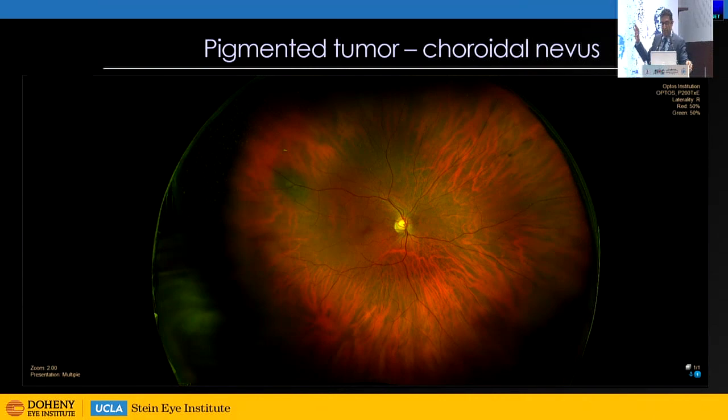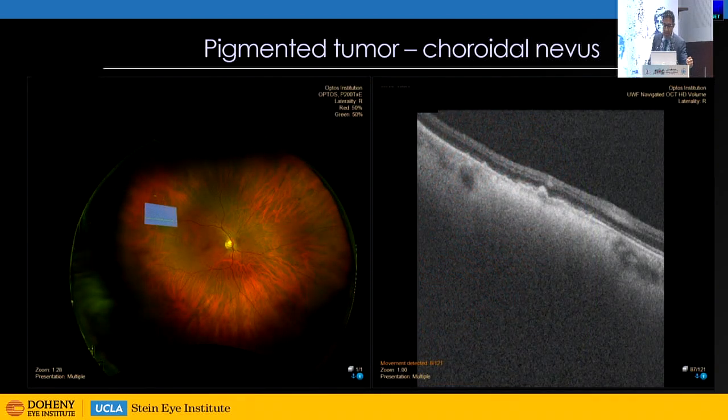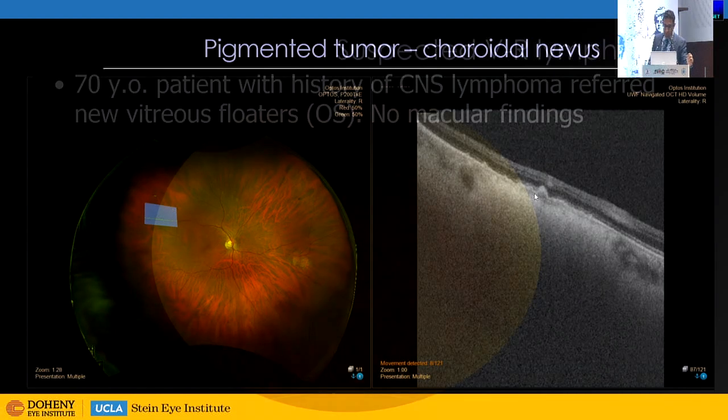Again, sometimes this is pretty obviously a nevus that you can appreciate here, but sometimes we get pigmented lesions where we're not so sure, and sometimes they're so small that it's difficult to measure with ultrasound. This we found OCT to be quite valuable. This patient obviously has a very typical appearance of a nevus on OCT imaging. Again, we can get the scan wherever we want, and you can see that there are drusen overlying it as well.